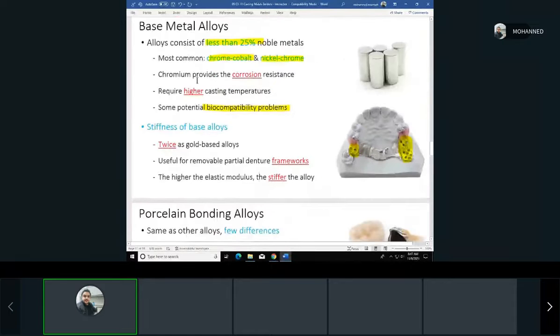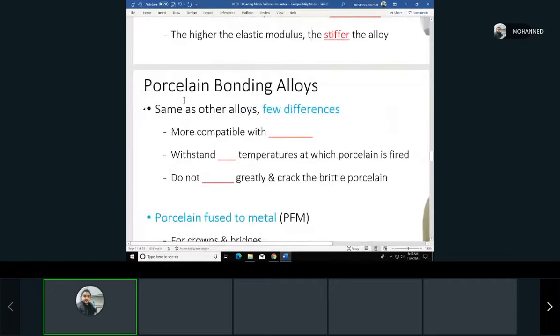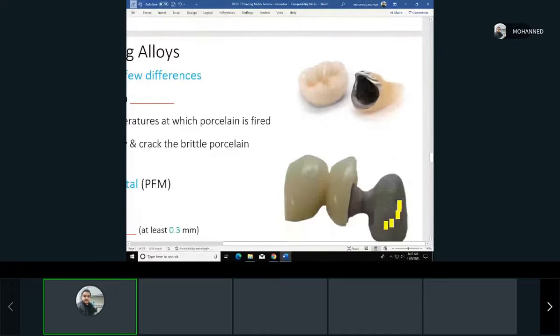We have another type of alloys in dentistry that are similar to the ones that we talked about, but they're made a little bit different so that they can bond to porcelain, right? We were talking about porcelain fused to metal crowns, which have a metal portion, which you can see here. And then we build it up with porcelain. That's how the crown looks. In an X-ray, it will show you the metal part, and sometimes you will not see any of the porcelain part, because the metal is what you can see in X-ray.